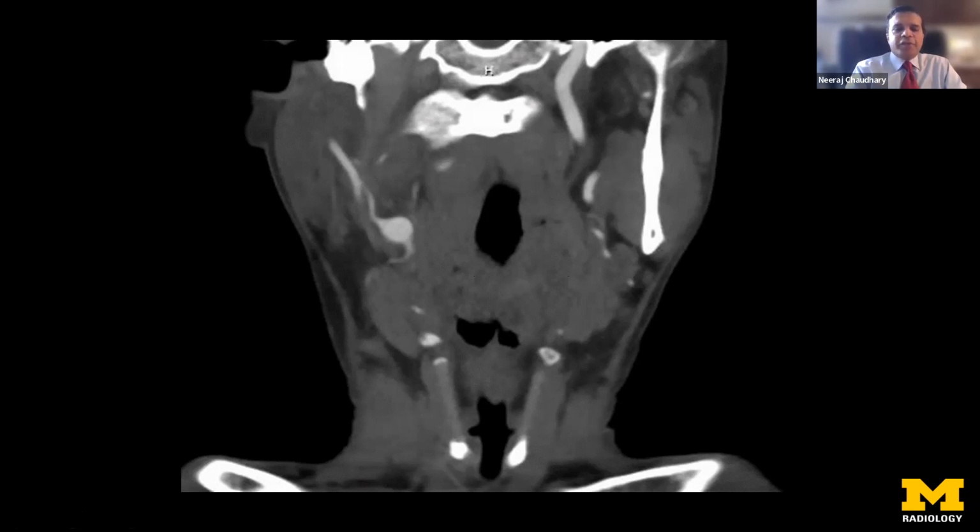But these are cases where, if you select specific patients for treatment, you can get dramatic results. This patient, I think we salvaged function so that he could get back to his profession. So that is a tremendous marvel of medicine nowadays. But dissections in blood vessels are difficult to treat. It is difficult to assess how far the dissections extend and how many stent-based devices you will need.